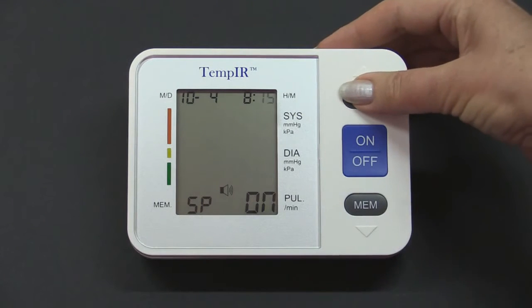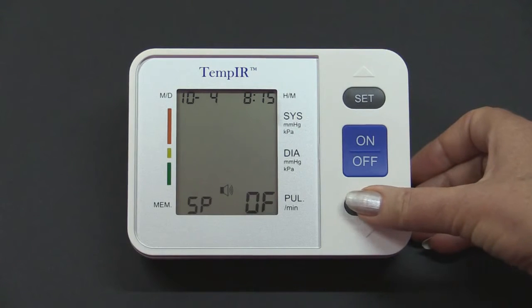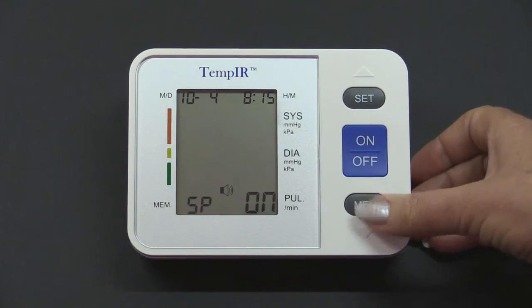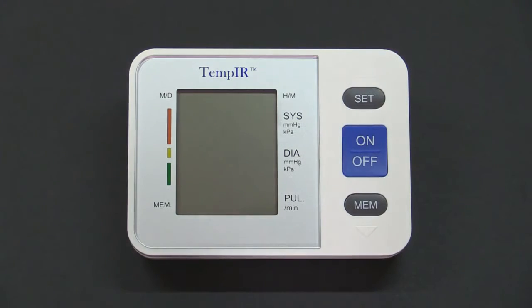Press Set again and the speaker option will flash. Press Mem to select off or on. A final press of the Set button will turn the unit off and the settings will be remembered.